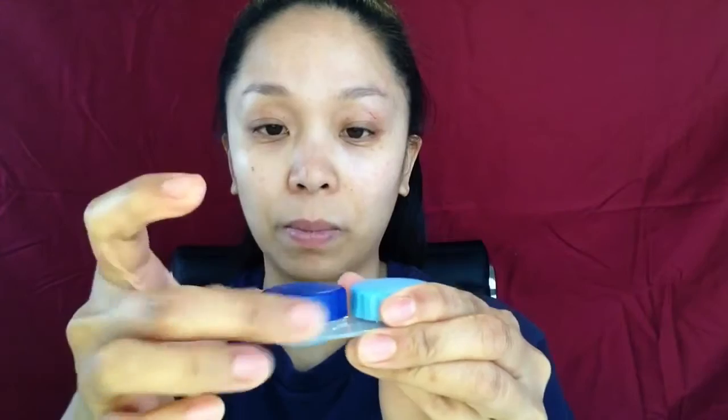And then just pick it up, hold it like that, and make sure the contact lens is facing like a cup.